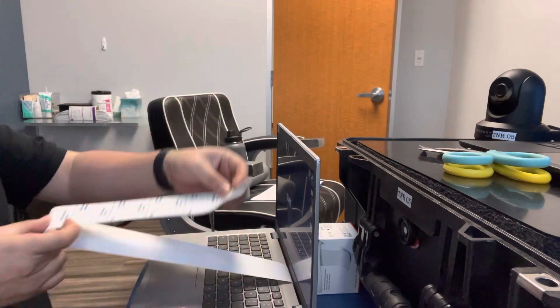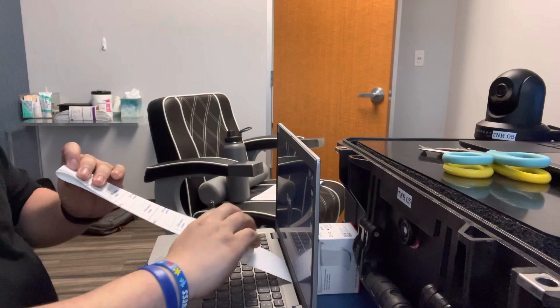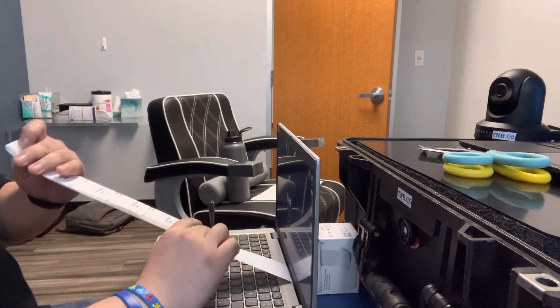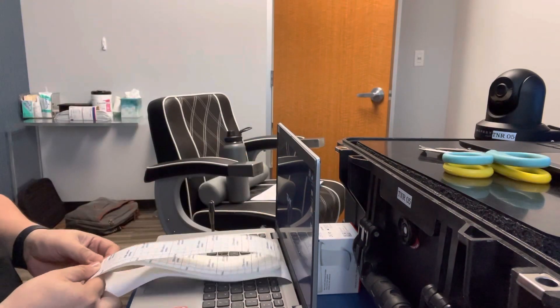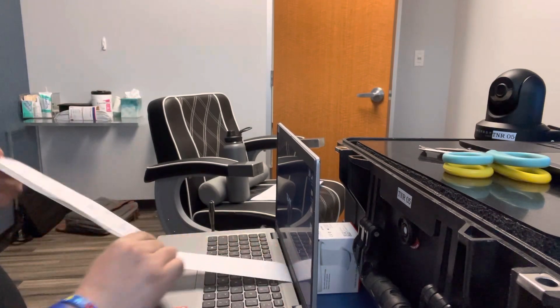And now if you start rolling — one — pinch it again. The pinching is very important. Like that, see two? I think it's like 29, three.